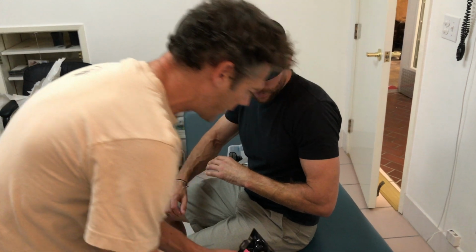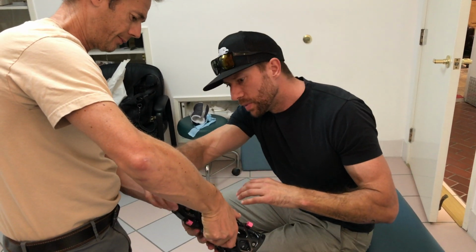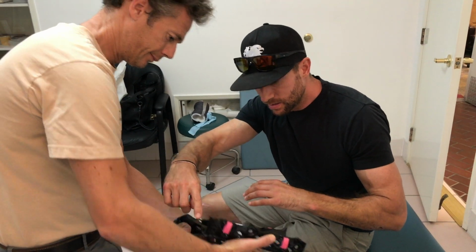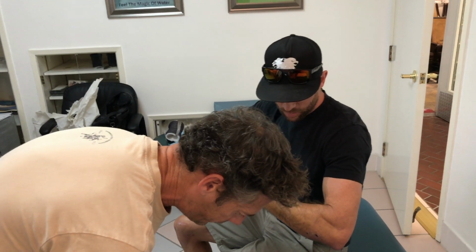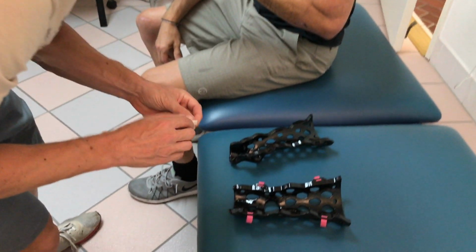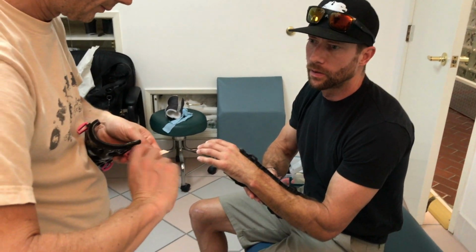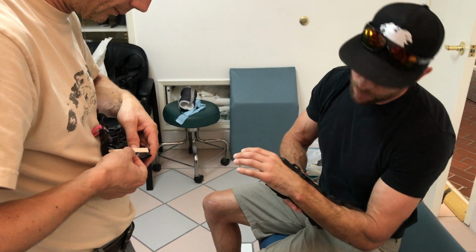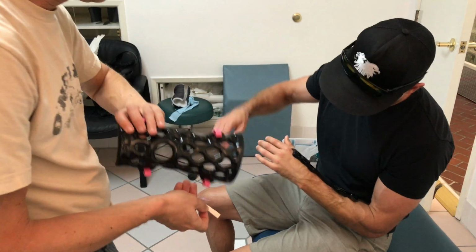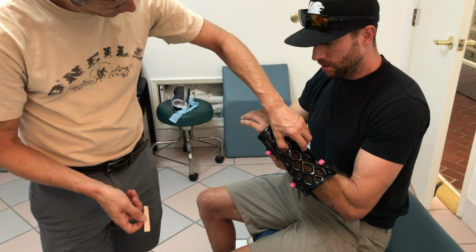So when you were looking at this, this side, you were talking about putting it under here, right? So no, my under thumb, so it would be under here. Yeah, like this area here. So this part of my hand felt a little bit of space. All right, so here's where my hand is. So we're just gonna go right in here, right? I think, but I don't know if it needs to go that far across the hand. I think it's more in this area here. Just rest this. Yeah, let's see.